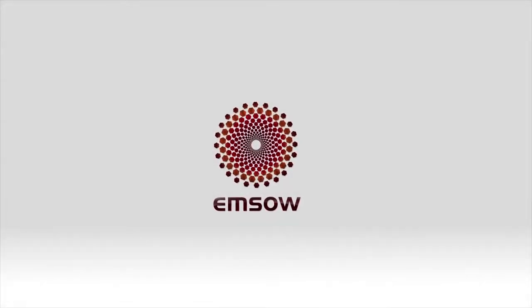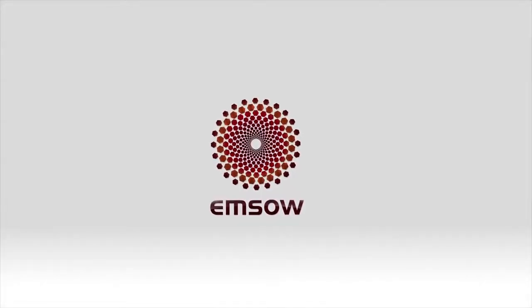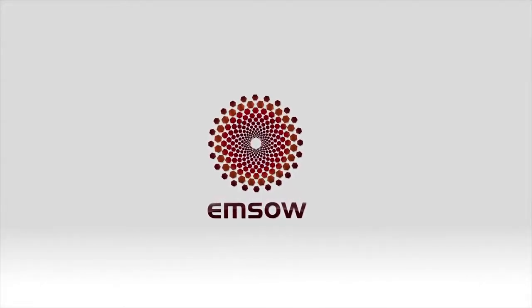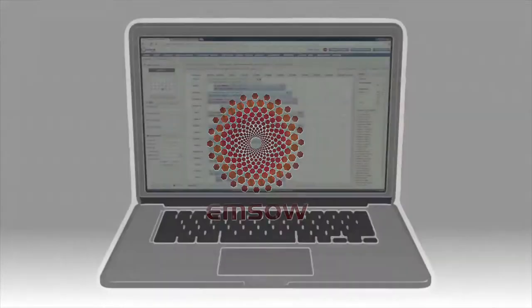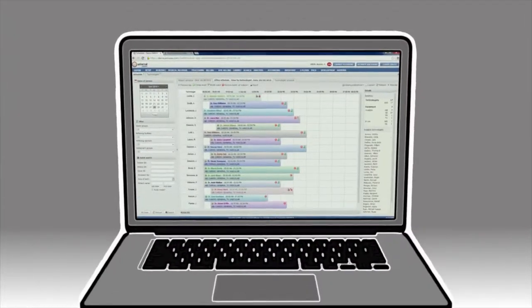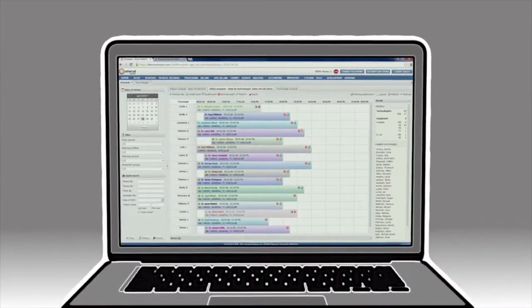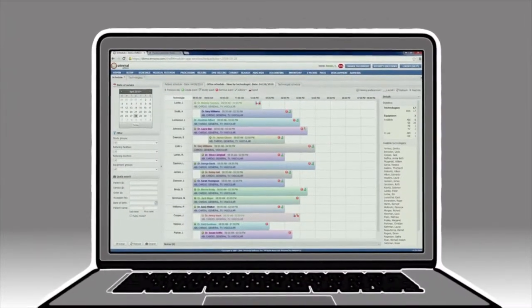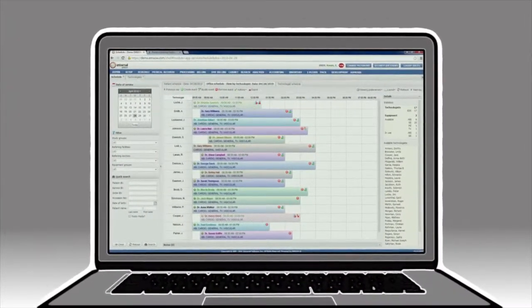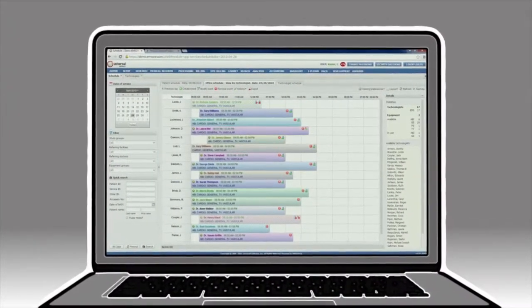Welcome to your guided tour of EMSOW, the cloud-based application designed to help mobile radiology companies automate their complex workflows. Let's get started.